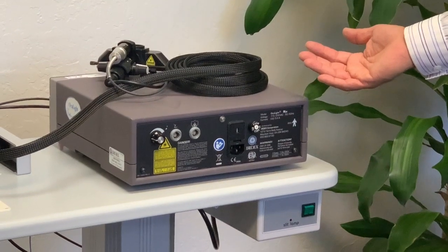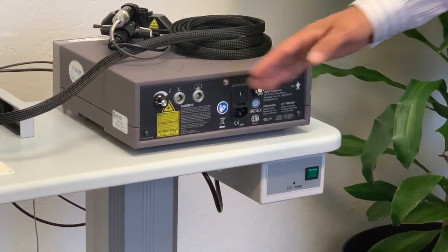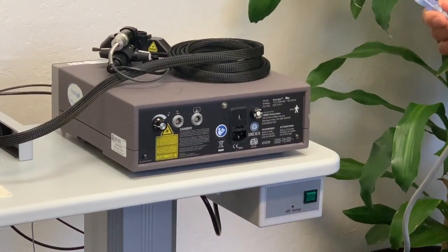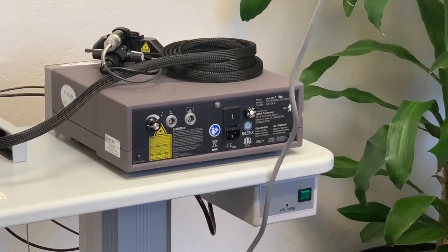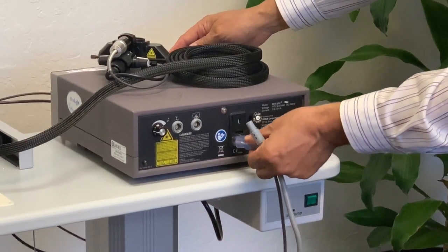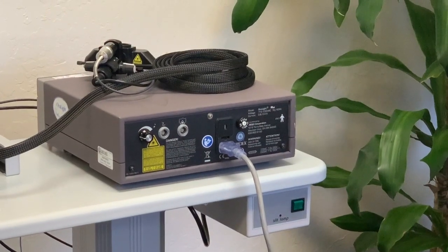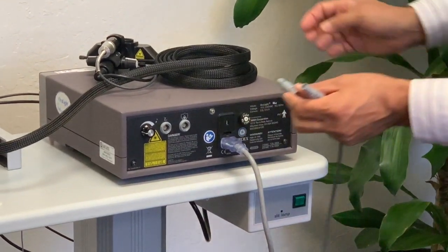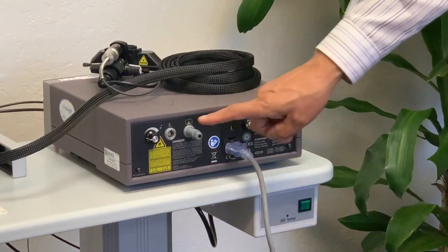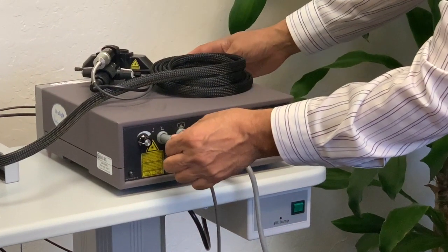This is the back of the SLX laser, where we have some connections I will show you for setting up the laser properly. The AC inlet goes to the AC inlet — press. There is an interlock plug; the interlock plug goes to the interlock — click. And the symbol here is for the foot switch, and the foot switch goes right here.